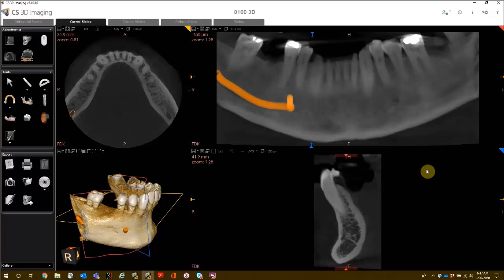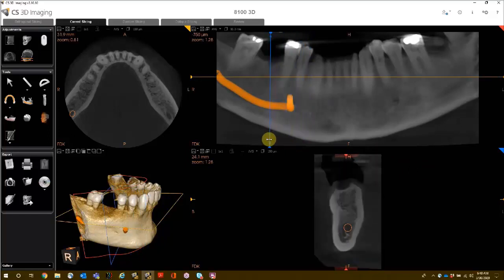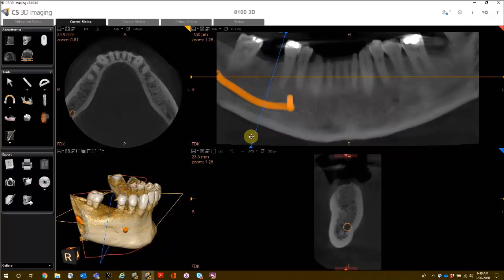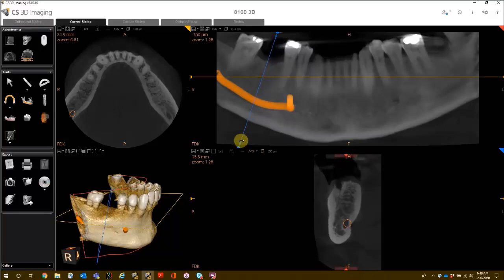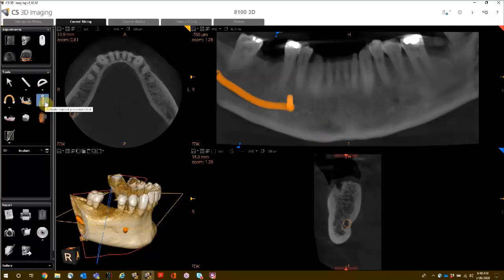To place an implant, open the Curved Slicing tab. First, align your oblique coronal slider tab in the position where you want to place the implant — the inner beads move the line at an angle. Once positioned, activate the implant placement tool. If you have not already added to your implant library, you will be prompted to do so the first time. For more information, see the recorded class on managing the implant library.